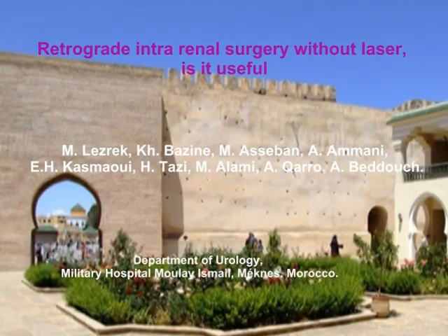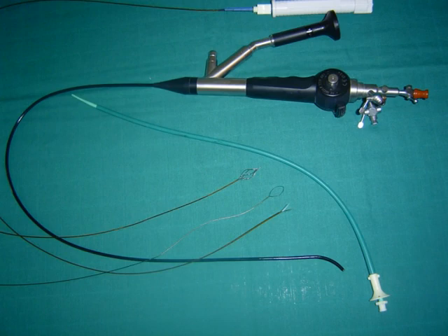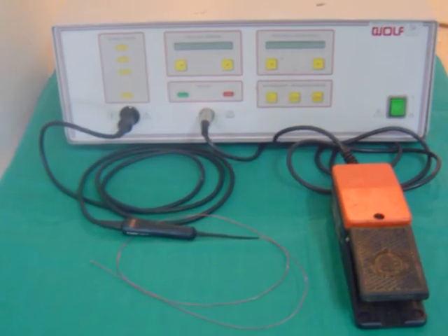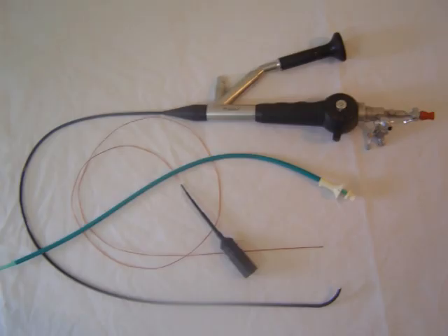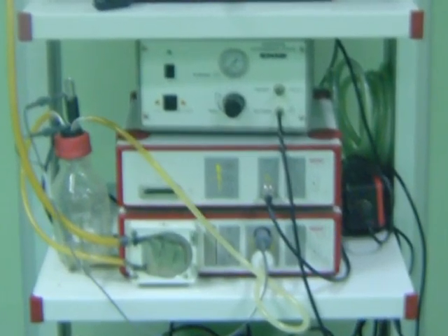We present our experience with retrograde intrarenal surgery without laser. The flexible uretero-renoscope is used mostly with electro-hydraulic lithotripsy with two French electrodes. Rarely, ballistic lithotripsy is used with the nitinol probe. Mostly our patients had small stones.